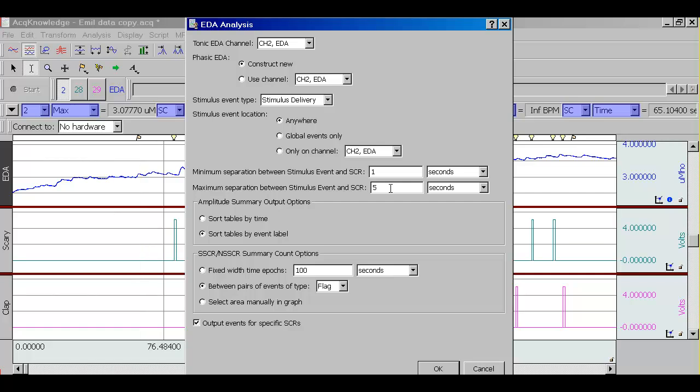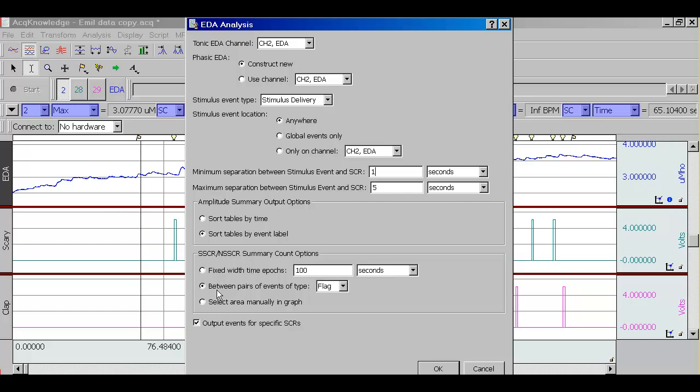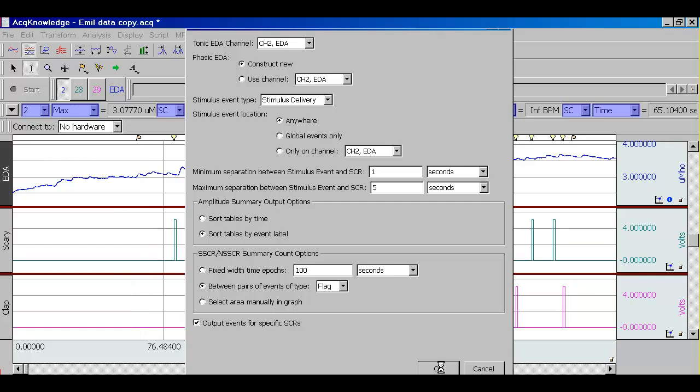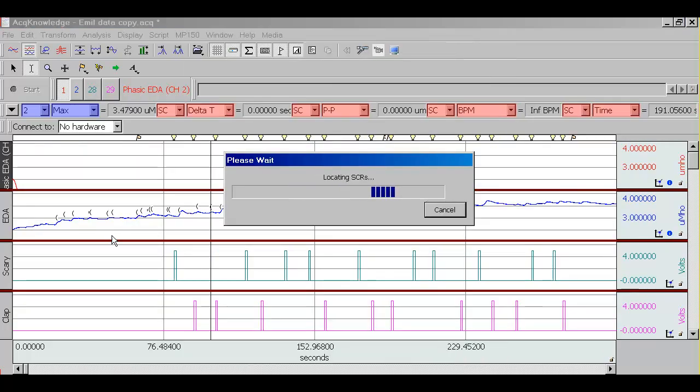The software will score the electrodermal activity data and provide you with two types of skin conductance events: specific and non-specific. The specific ones are those events that have been above the specific threshold that you set in the preferences and also within a certain time interval following the stimulus presentation. Non-specific skin conductance events will be all the other events. In addition to marking these events and obtaining data for their amplitude, rise time, latency, etc., we'll be able to obtain data between pairs of events that mark different experimental conditions. This will allow us to look at the frequency of specific and non-specific skin conductance events within each condition of the experiment.